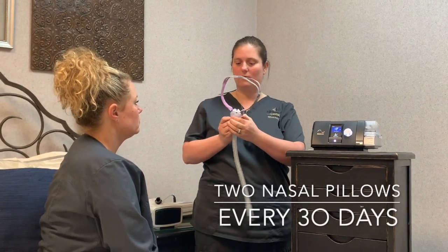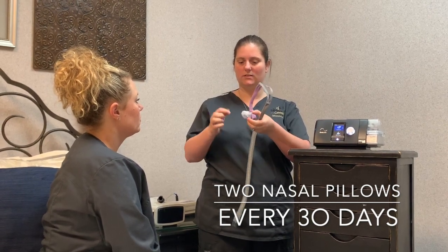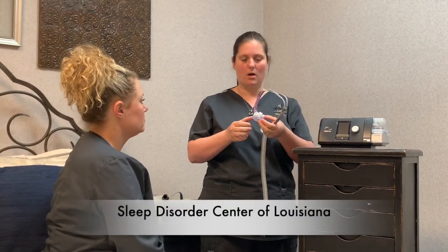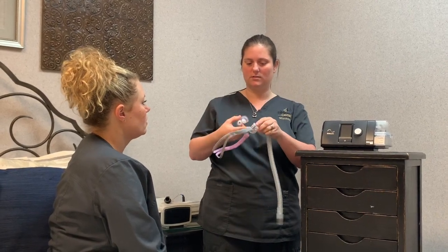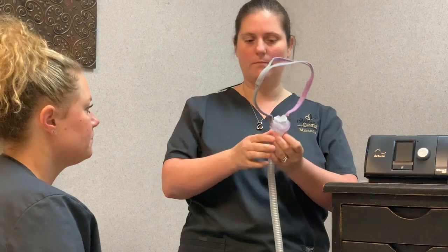You have an extra one right here. A nasal pillow — you are eligible for two of these every 30 days also. You'll clean this with an alcohol prep pad every night or every morning, just to get the dirt and oils off of it from the night before.